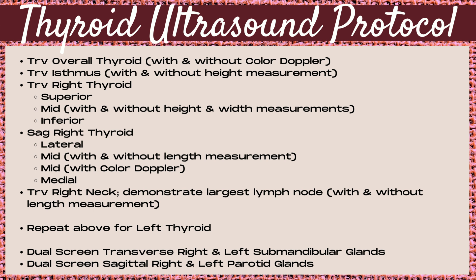Then you want to repeat all of the above for the left thyroid and the left neck. After completing the thyroid protocol, take dual screen images — first of the transverse right and left submandibular glands, and next a dual screen image of the sagittal right and left parotid glands. And this completes the thyroid protocol.